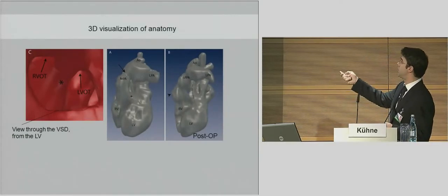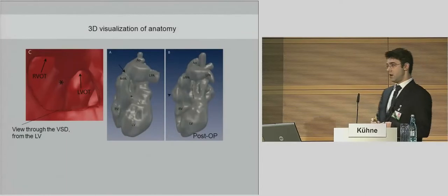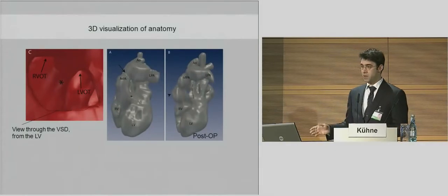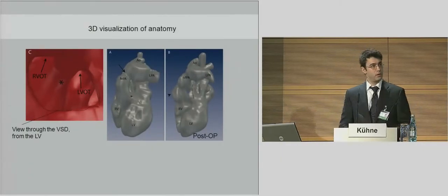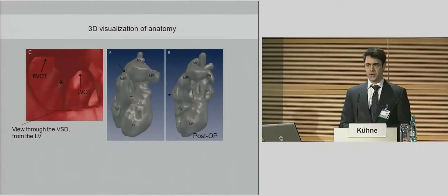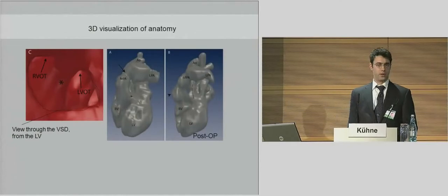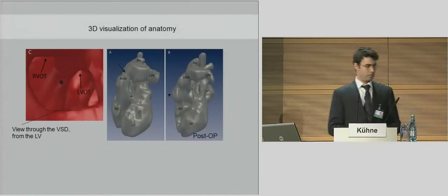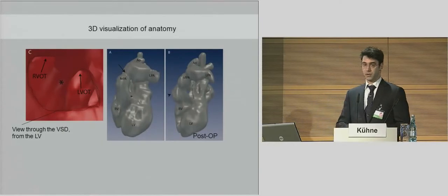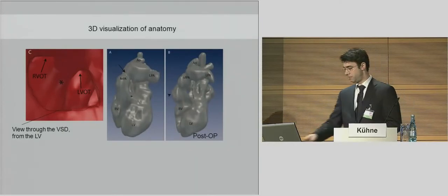Okay, this is good for diagnostics, and I like diagnostics if it's standardized, if it's not observer dependent. I mean, just imagine Mr. Chowi looks out of the window in January, rain, grey, getting depressive, and says, okay, I'm leaving Berlin, and then we do not have such high quality prenatal imaging anymore because it's so highly observer dependent.